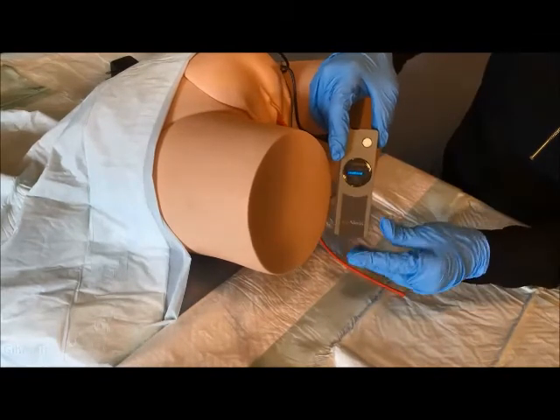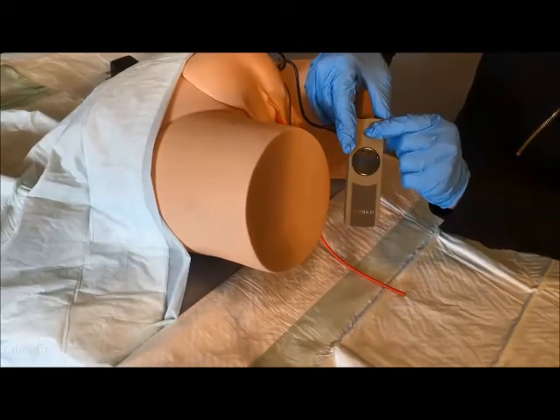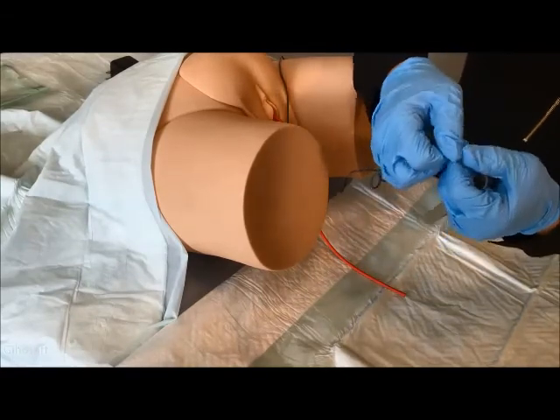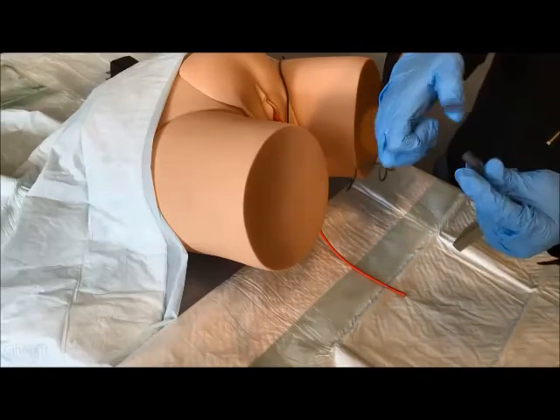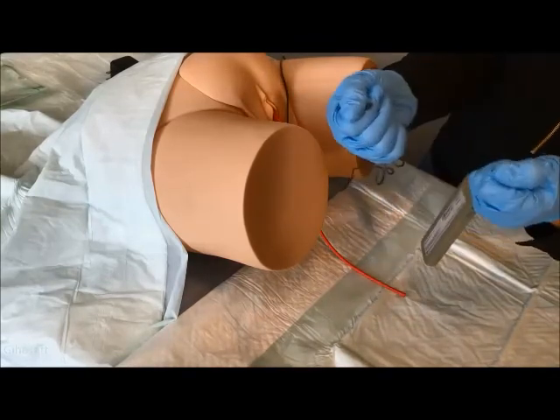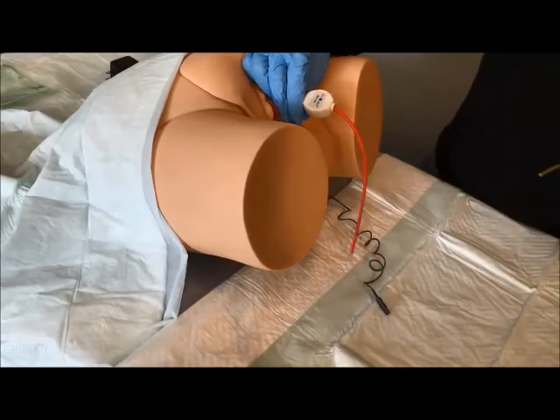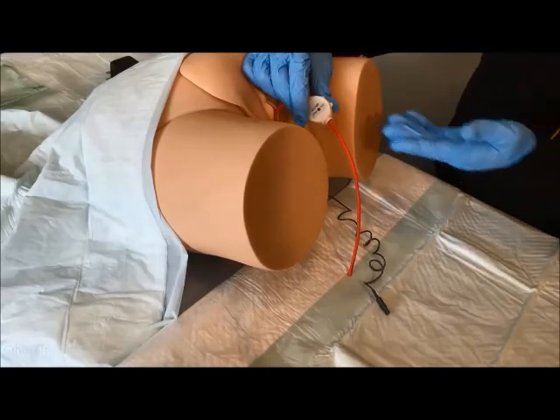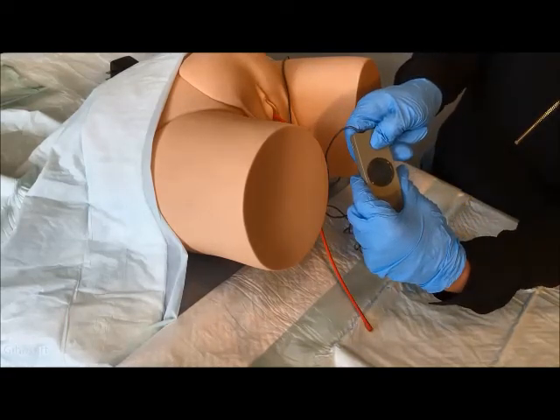For showering and bathing, the Uroshield driver itself is not waterproof and should not be immersed in fluids. Before cleaning the patient, switch the Uroshield off by pressing and holding the power button. Disconnect the actuator correctly by holding both cable ends and disconnecting them — never pull from the wire; always grab from the ends to disconnect. Leave the driver outside the bathroom. The actuator should remain attached to the catheter while the patient is showering or bathing. Following bathing, dry the actuator with a towel and reconnect the driver, pressing to turn the therapy back on.